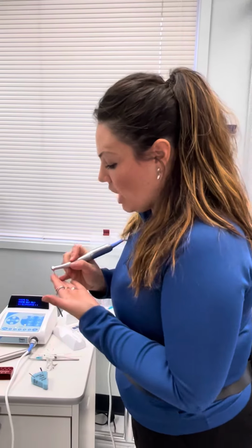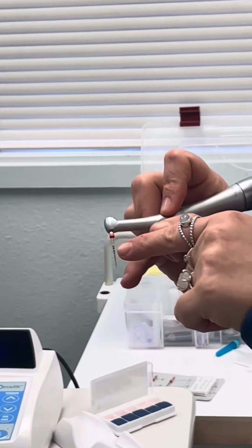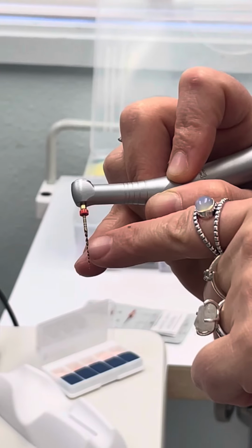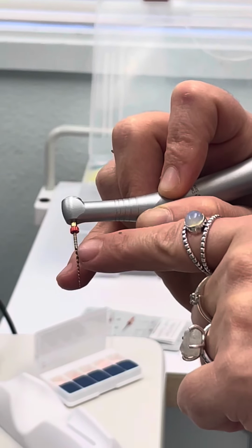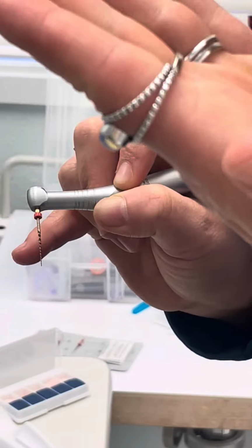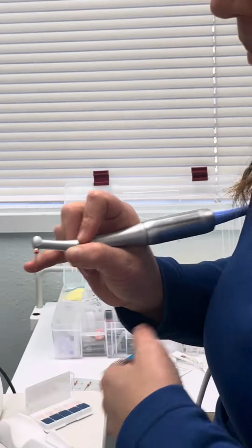The other thing that he's checking is, and I keep saying he just because I have a doctor in mind when I'm talking, the initial part, he should have his flutes be loaded here. The middle part, his flute should be loaded here. Lastly, the flute should be loaded here. If we have loaded flutes here and here, great, keep going. But if we don't have it here, that means step up a size. If we have it here, but we're just not getting to the apex, that means step down a size.